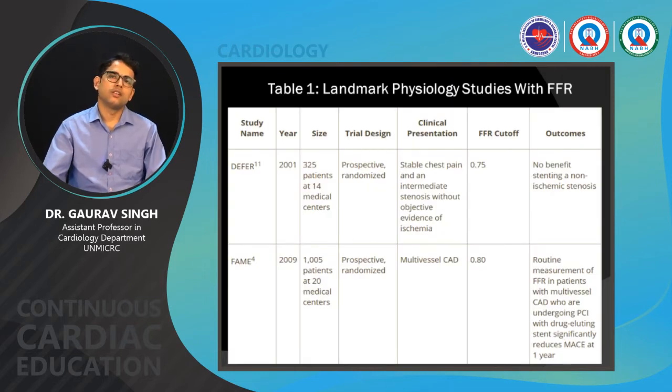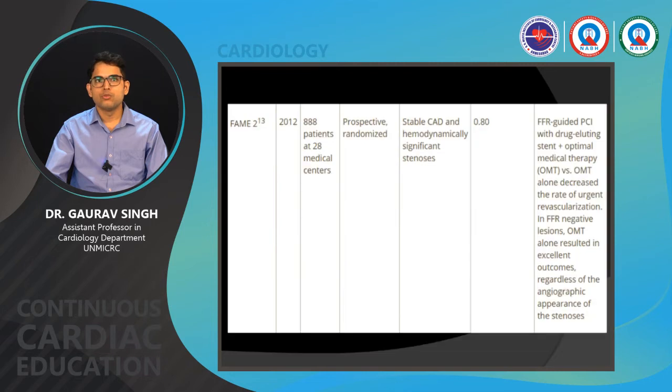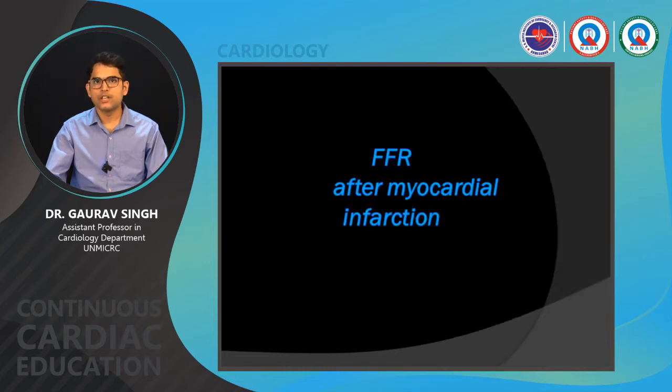So, these are some of the landmark physiological studies with FFR. First, there was the DEFER study in 2001. Then FAME 1, FAME 2, FAME 3. These are the studies which have shown that FFR guided PCI is superior to angiography guided PCI.